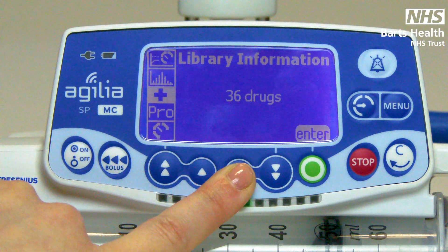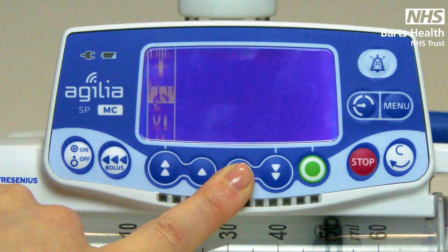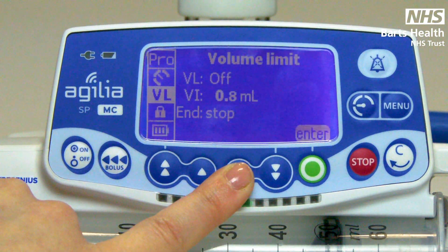Information only on your drug library, the profile you are working in, pressures, and volume limit.